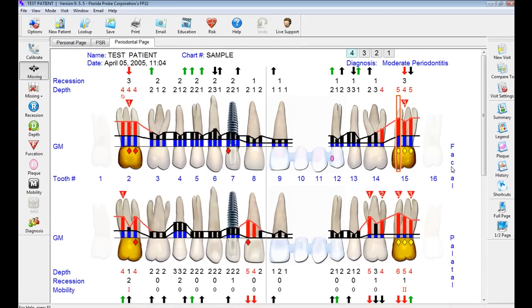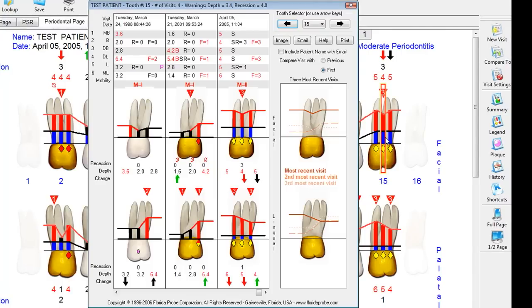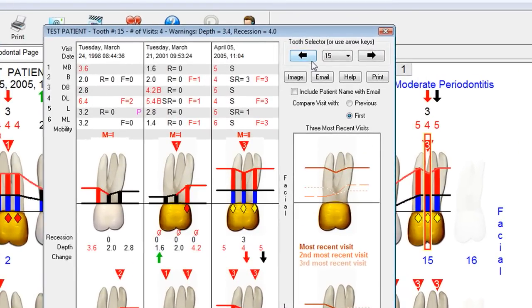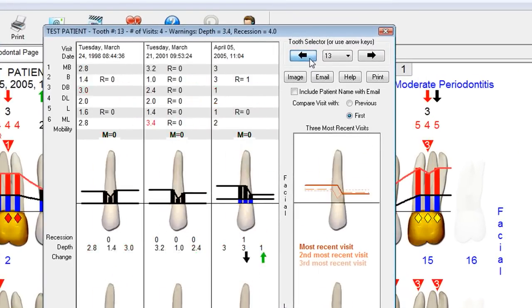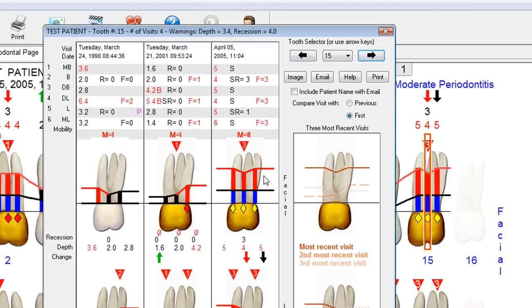You can double-click any tooth in the mouth, or click the History button, which allows you to bring up a site-by-site comparison for each tooth. If you want to flip to other teeth, you can do so instantly. The beauty of this screen is the ability to see a change in attachment level over time, not just a change in pocket depth. Again, you can email or print these charts.